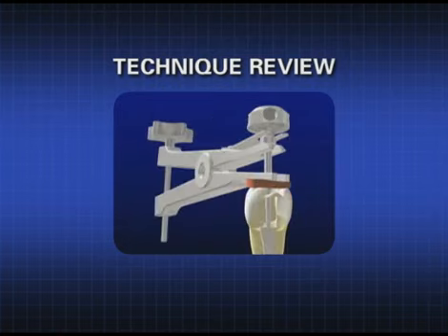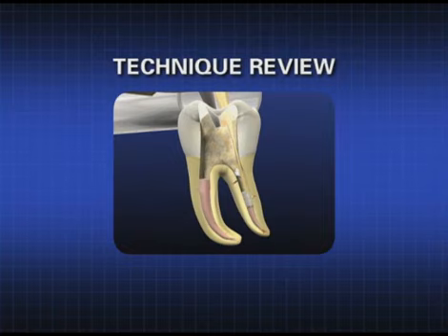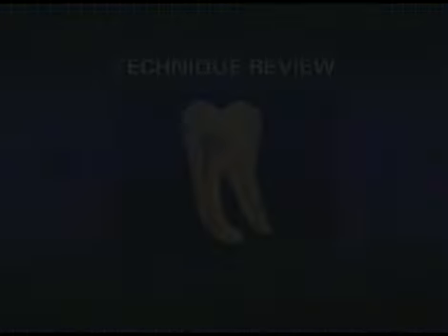If appropriate, mount extracting pliers. Note the compressed rubber bumper protects the tooth from the removal forces. The energized Endo 1 may be advantageously placed against the post-engaged tap to synergistically facilitate the removal effort. Following post-removal, an ultrasonic instrument may be utilized to remove residual restorative materials. Remember, you will be dealing with a variety of post types and configurations, core materials, and cementing agents, so you'll have to remember to think, visualize, plan, and execute.